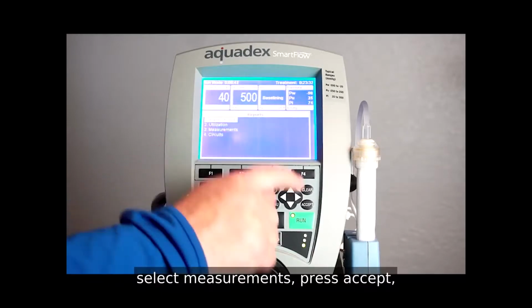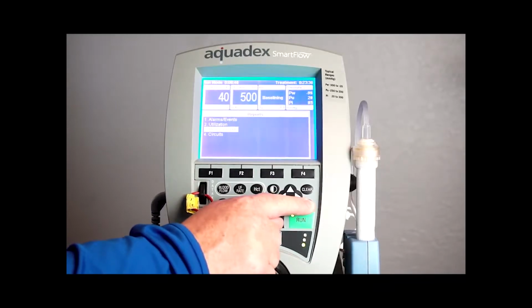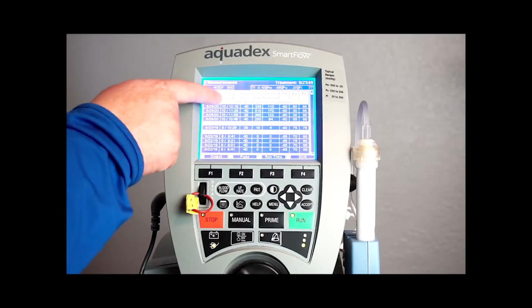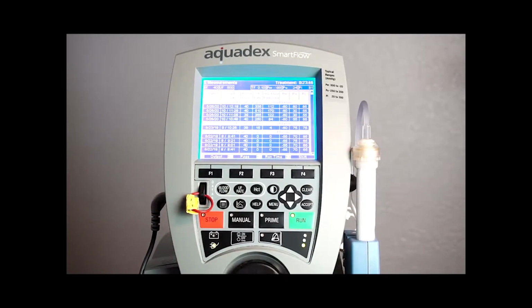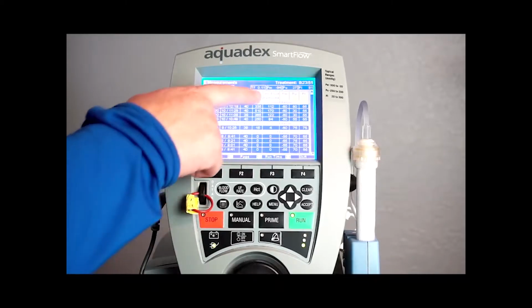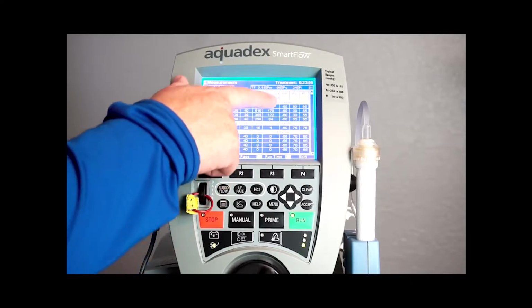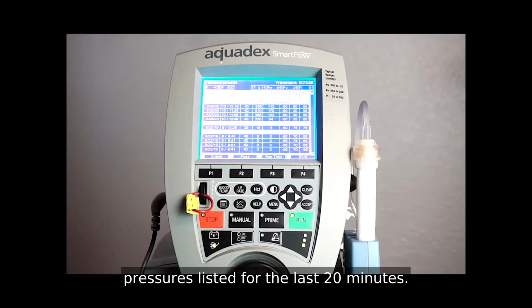Select measurements, press accept. Circuit time in 20-minute increments, blood flow rate averages, ultrafiltrate rate programmed, fluid removed over last 20 minutes, pressures listed for last 20 minutes.